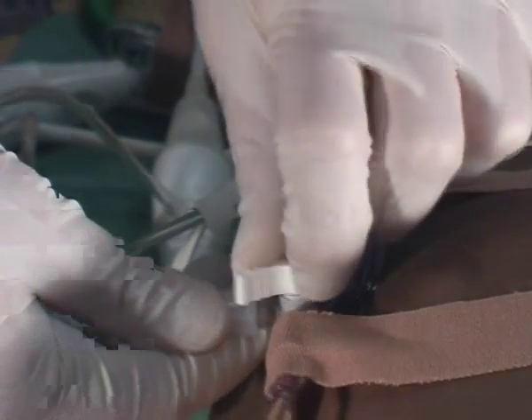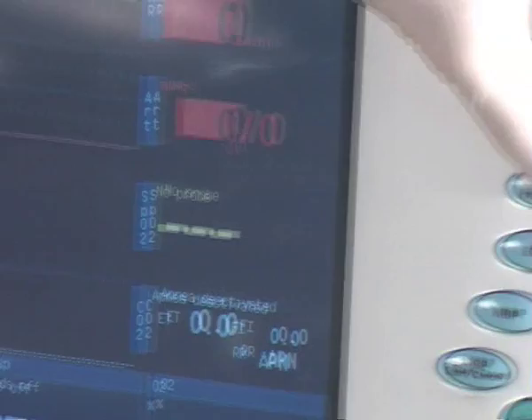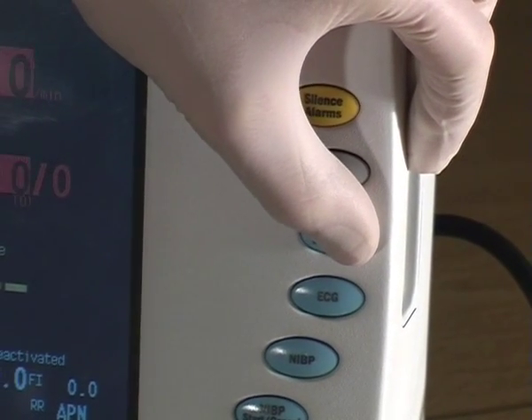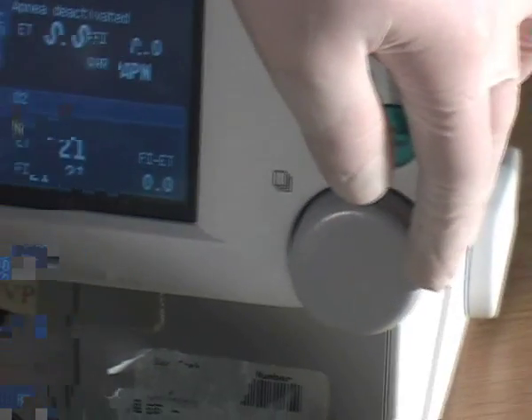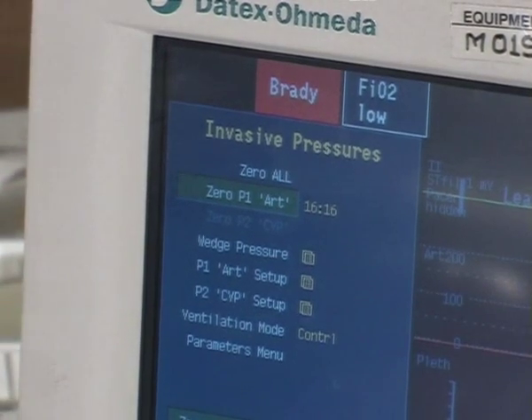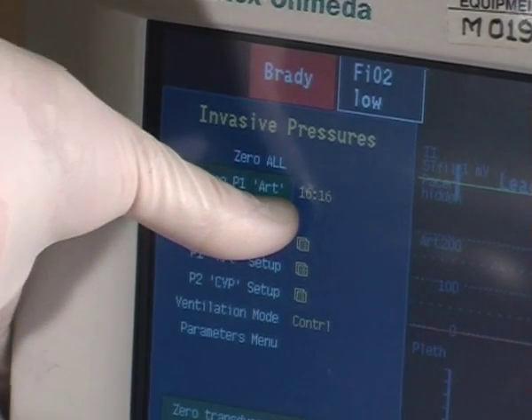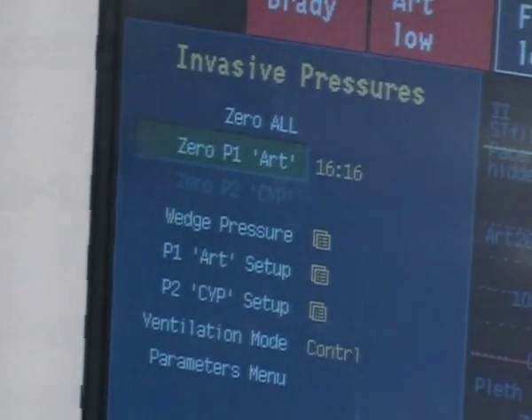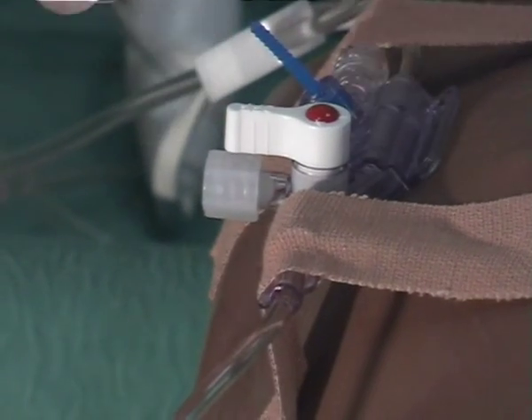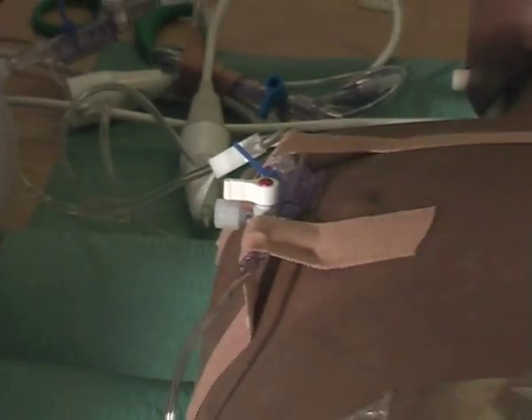Turn it off to the patient and take the cap off. Then go to the Datex monitor and press invasive pressures. Go down to the grey wheel and select zero P1 art. You will get a confirmation of successful zeroing with a time stamp. If unsuccessful, it will come up as failed. Once successful, place the cap back on and turn it back to the cap position. You will then get a tracing of your arterial pressure.